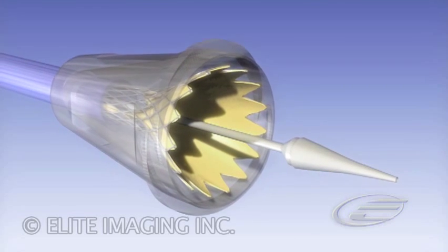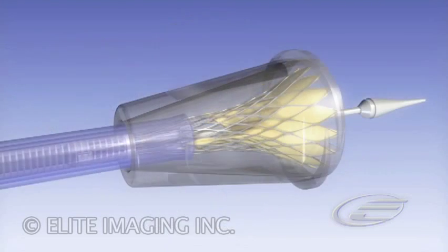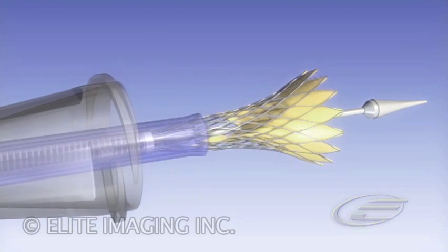Examine pericardial valve leaflets. Slide the outflow cone over the outflow tube and catheter.